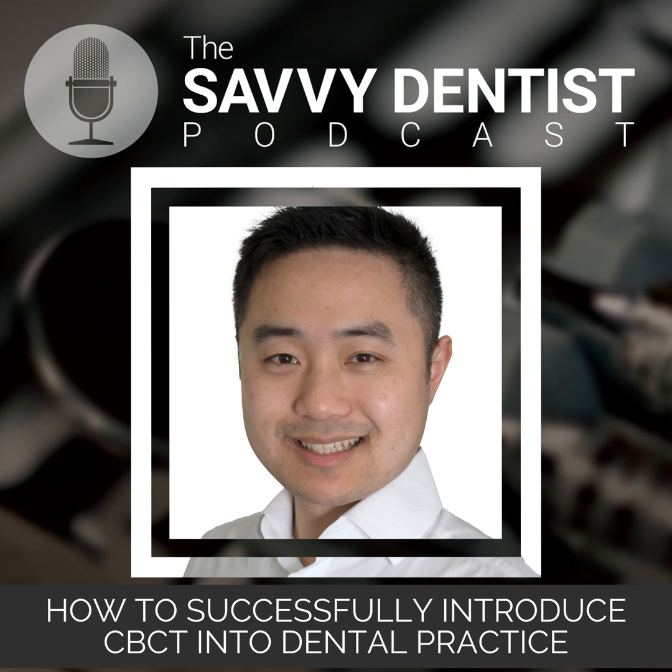Yeah. So I'll split that out into two sections. One is, as you said, the clinical diagnostic side of things, and the other side is the commercial and business benefit. If we talk about the clinical benefit and the advantages over traditional 2D, it is that it gives you 3D information. That can be quite important because with 2D imaging, sometimes the images can be distorted because of magnification and artifacts and things like that. But with 3D imaging, the measurements are much more precise. So this is very useful in procedural planning, and for subspecialties such as endodontics, orthodontics and periodontics, where they need that high-precision information. So for example, with implantation, you want to be assessing the distance to adjacent structures like the inferior alveolar canal.